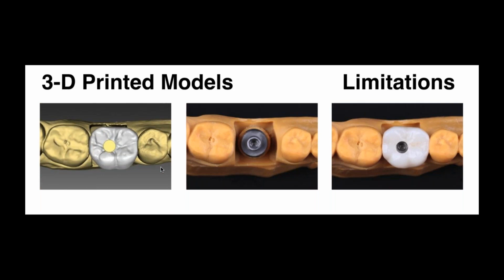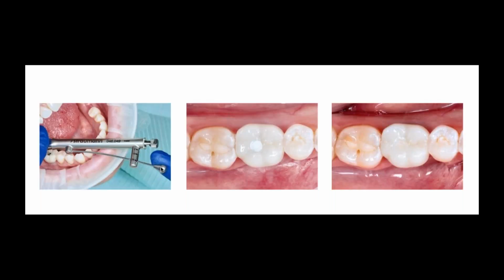You can see here this is the Variobase from Straumann, and we created this bevel, and we went with a zirconia restoration that is stronger, and we could manage it thinner, going around that titanium base to be able to close that aspect there.